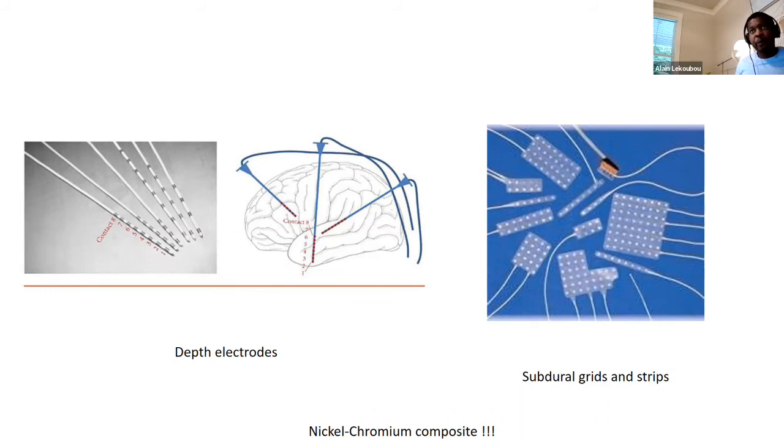You get a patient MRI. You see the left and the right temporal lobe are a little bit bright. It's what we call scar tissue in the left and the right side of the brain. And that's like, okay, the right hand and the lip smacking are not perfect indicators that things are coming from the right side. In a small proportion of patients, it can come from the left side. And your MRI tells you that the right side is abnormal, but the left side is also abnormal.